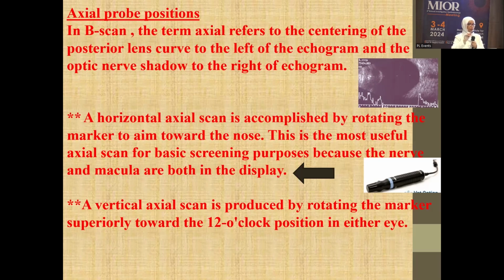If you like to read about sonar, there is the biggest book for sonar called Sandra, okay, showing different positions for the arrow and the probe. But let us do something fixed. Make the position of the probe axial when you are going in the center of the eye, and let your arrow be nasal.